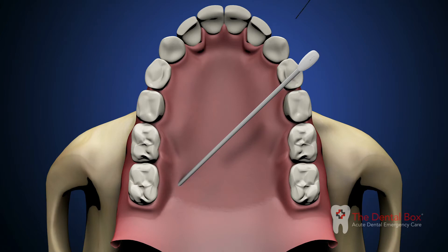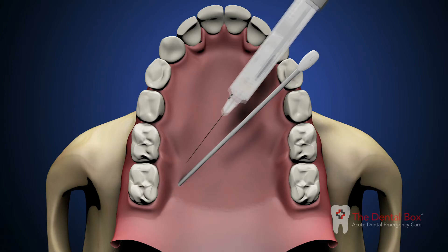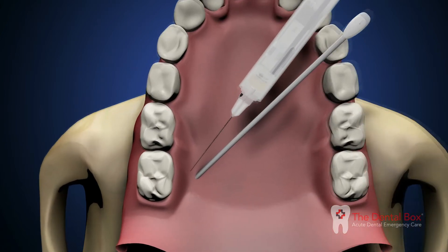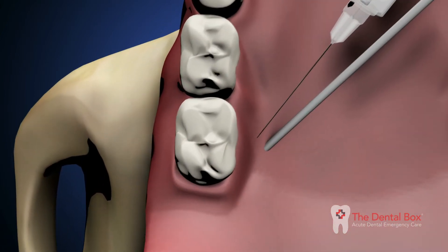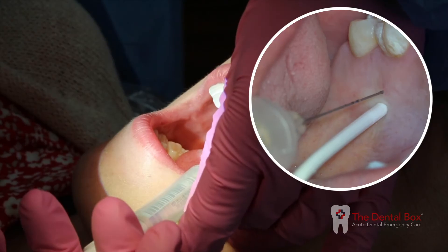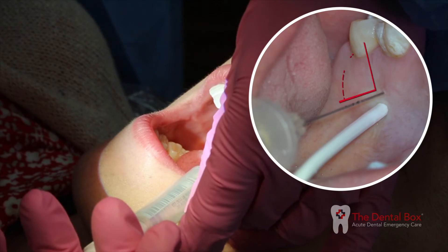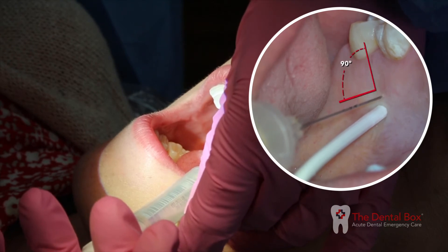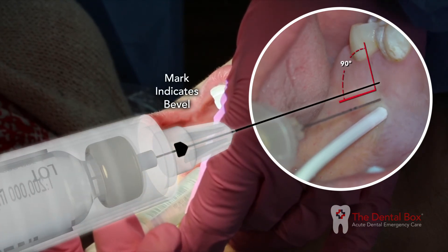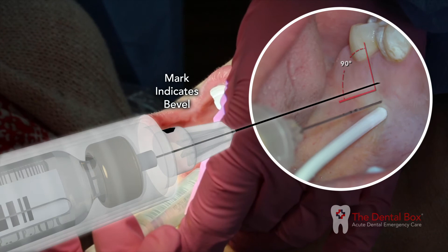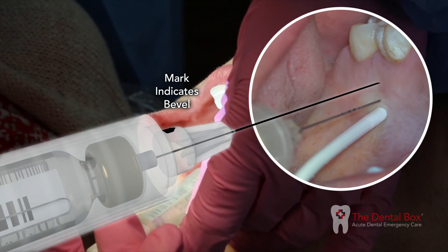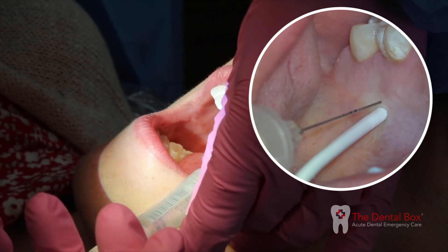Direct the syringe into the mouth from the opposite side with the needle approaching the injection site at a right angle. Then place the bevel of the needle against the previously blanched soft tissue at the injection site.